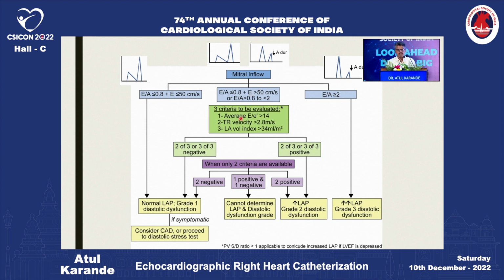recommends this flow chart to measure the LA pressure, which includes 4 parameters: the E/A ratio, the average E to E prime ratio, TR velocity, and LA volume index.